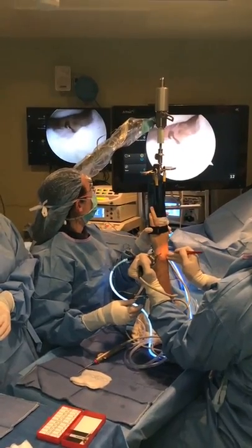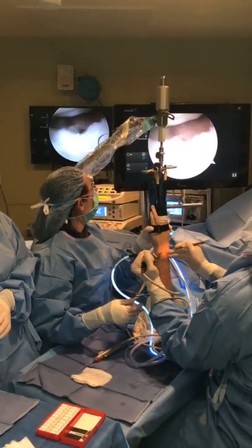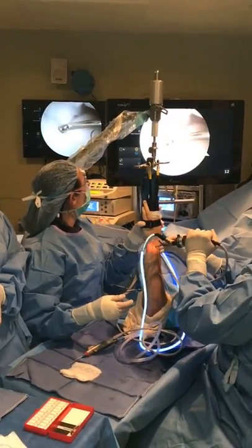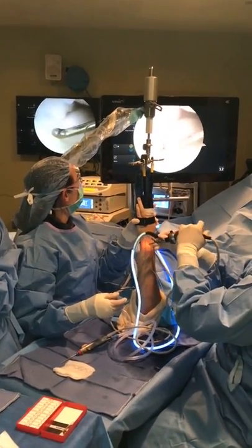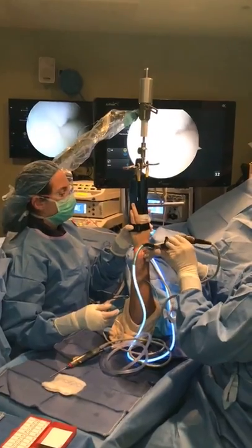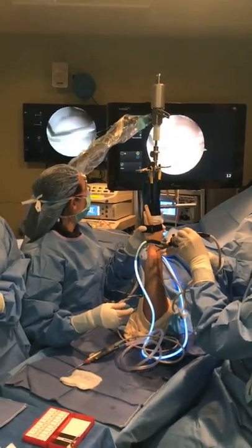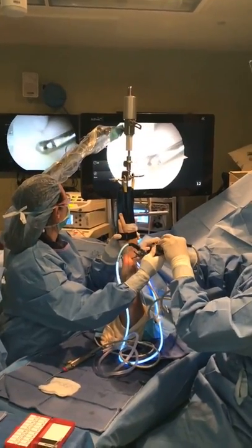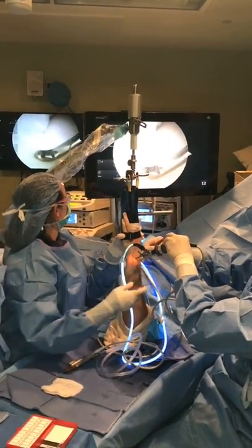Later on, I'll do a little shrinkage to this area. You see the capsule's a little redundant there. But so there's the start of the TFCC, and it should be tighter. It should be like a drum. Make that a little bigger, Kate. Okay, see, this is really loosey-goosey.